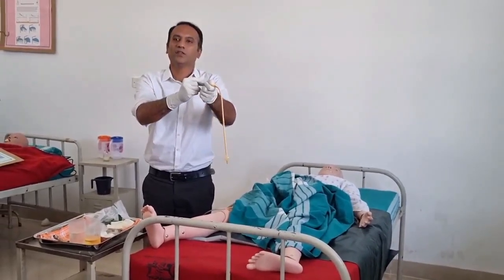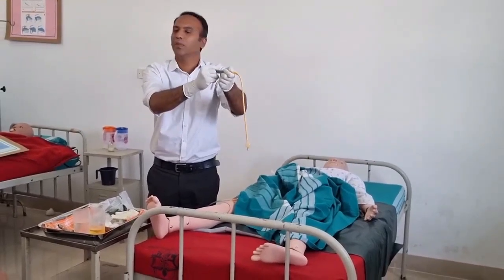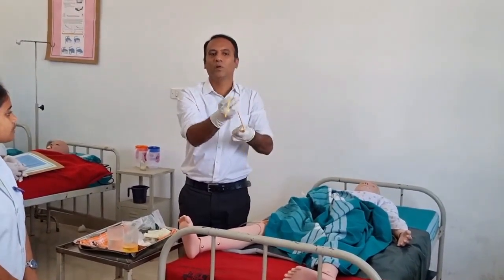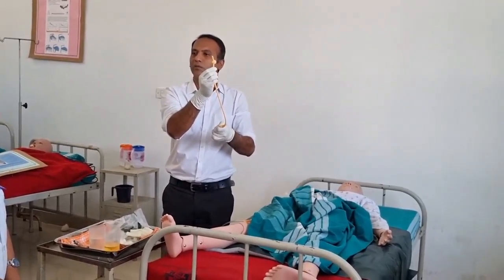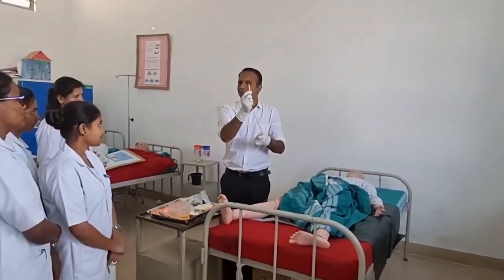So even if the bladder is full, with the pressure of the urine, this particular catheter is not pushed out from the bladder. This balloon holds, and prevents the catheter from being pushed out of the bladder. Hope you all understood. Thank you.